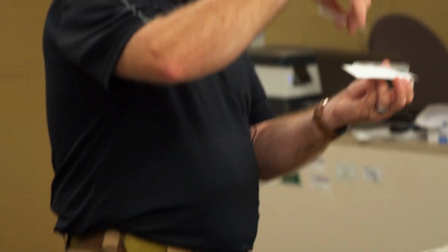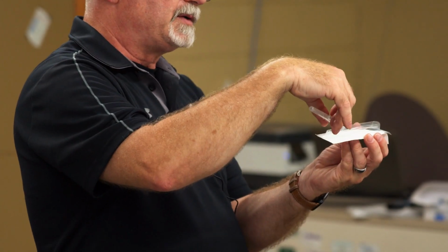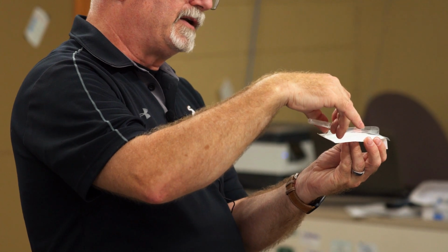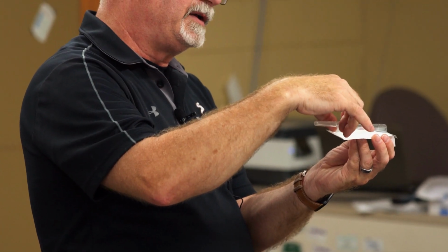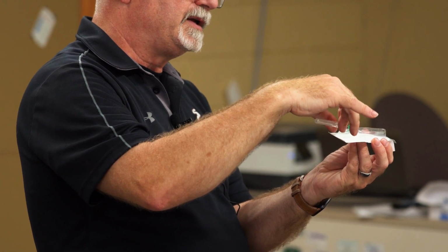So here's my best way of doing this. We'll skip the skin, but we go through the skin and poke into the vein. So about there, I'll get a flash. We should see blood filling up in there. Flatten out a little bit, go just a shade more, and then we advance and then I push down on the thingy, and it's gone. Now of course I can't take it back out and reuse it. But okay, I have cases of those too.